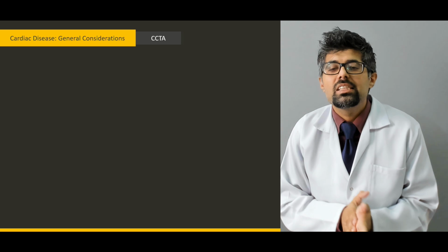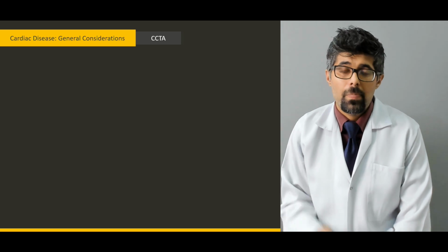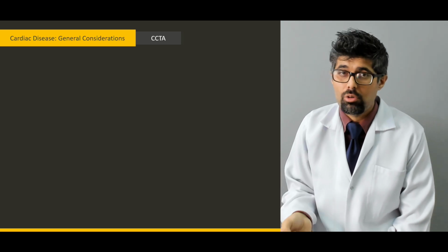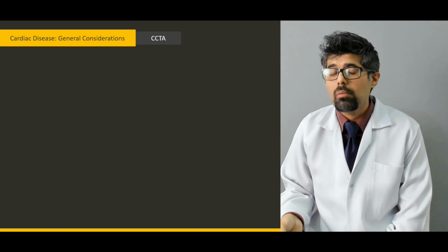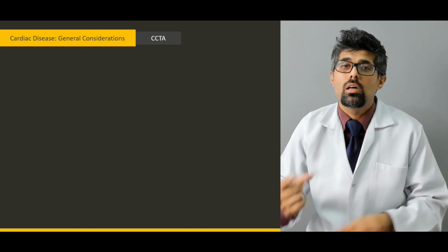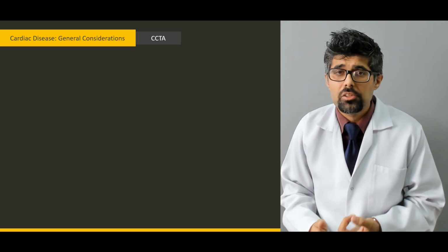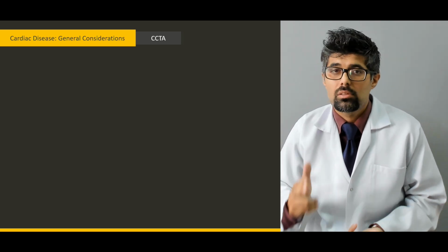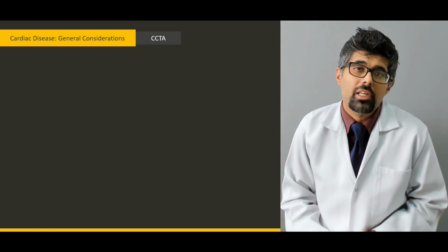Next, we have CCTA, or coronary CT arteriogram. Now, it must be noted that this is an arteriogram, not an angiogram. Angiography is an invasive technique. Arteriogram is not an invasive technique, though it utilizes a multi-detector with multiple slices. It is more extensive than the calcium scoring. It is still a risk assessment technique. It is by no means a definitive diagnostic modality.